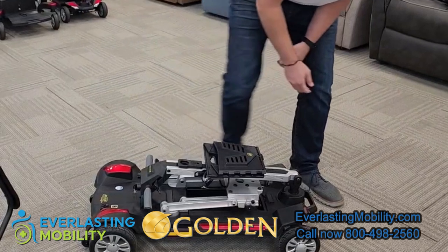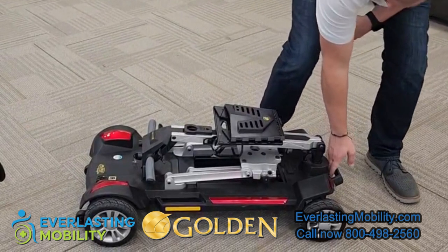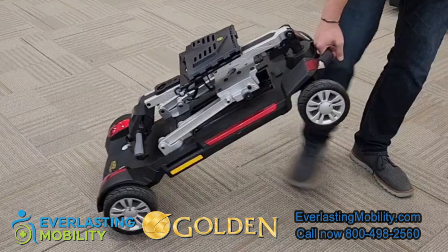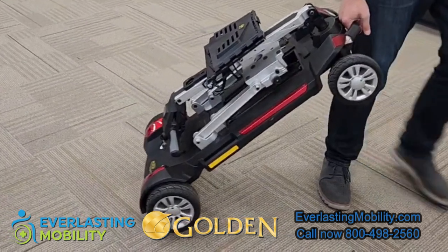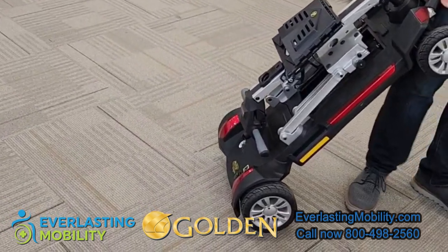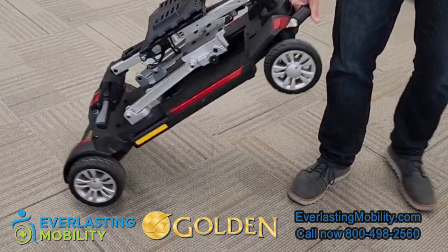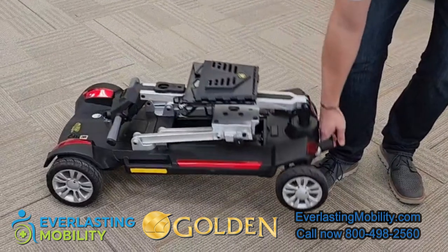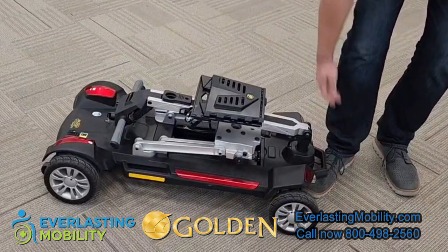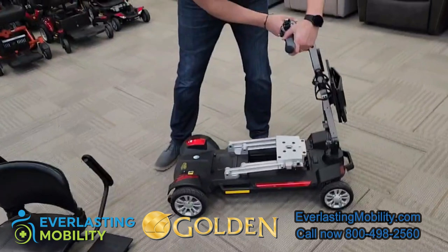Another great feature is the front handle, which lets you pick up and transport the scooter or pull it behind you. It was also designed so that when loading into a vehicle, you can lift the front wheels into the trunk first, then go to the back and lift the rear — rather than lifting the whole scooter at once — making the weight distribution much easier. This is a really well thought out design from Golden Technologies.